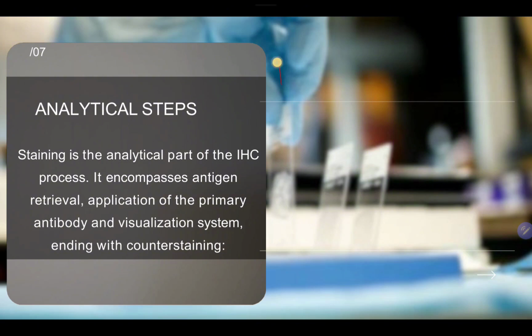Let's say for example, breast yung sample ni patient, then nag-positive siya sa biopsy. So ngayon, i-determine natin ano yung nag-cause ng cancer kay patient. So usually ang IHC dyan na mga stains, or the immunohistochemical stains, i-request ng doctor dyan with the ER, PR, and HER2/neu. ER, PR, estrogen receptors, progesterone receptor. These IHC stains po are needed for the oncologist to know what kind of treatment po ibibigay sa inyo.